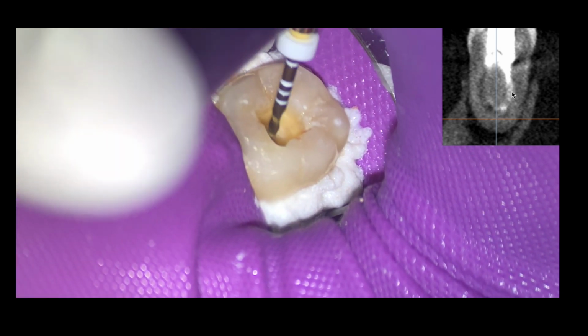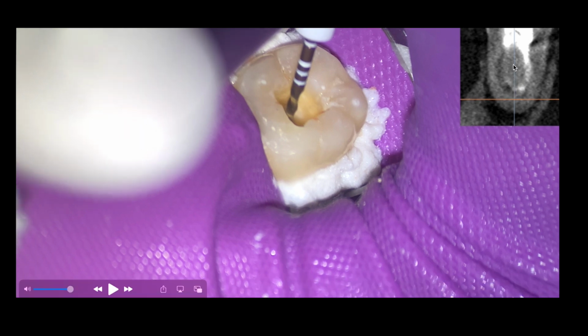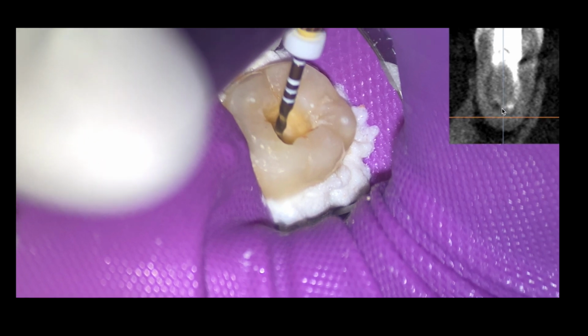So calcium hydroxide is beautiful because it's antibacterial, but it also dissolves vital tissue. So my concern was there's going to be vital tissue sitting here if we didn't place calcium hydroxide, and it may decrease the outcome of our root canal. So what I wanted to do was, knowing that this was a horseshoe, and knowing that when I took my 10 file in my pulpectomy stage, the file kind of went down to length and then curled back up, and then I pull it out and it looks like a horseshoe. So that was the two reasons why we placed calcium hydroxide in this case.